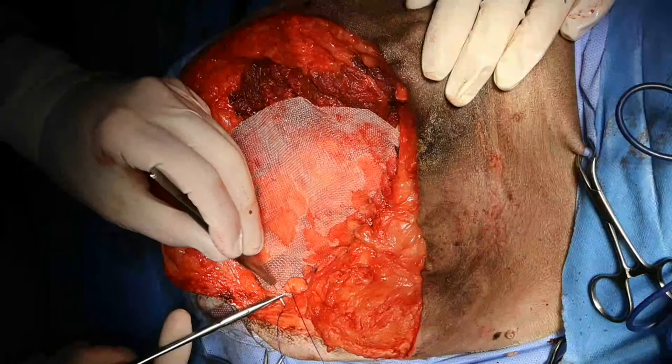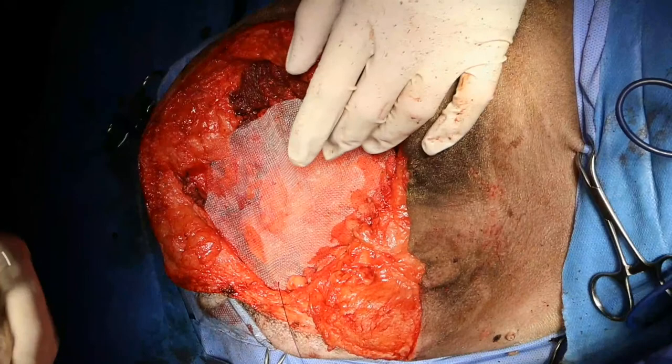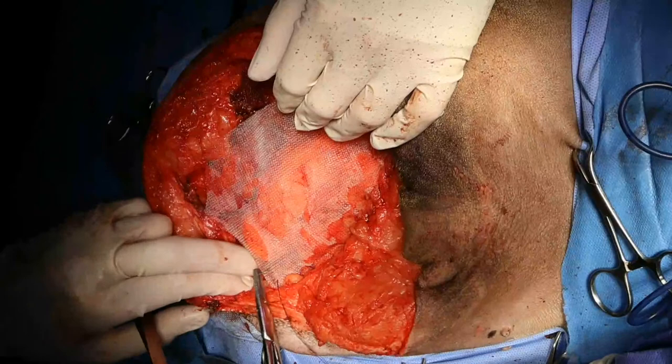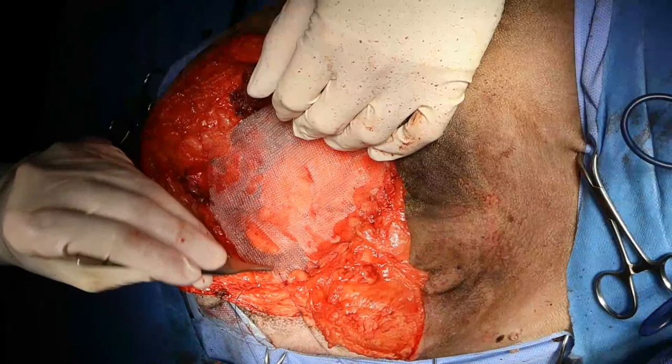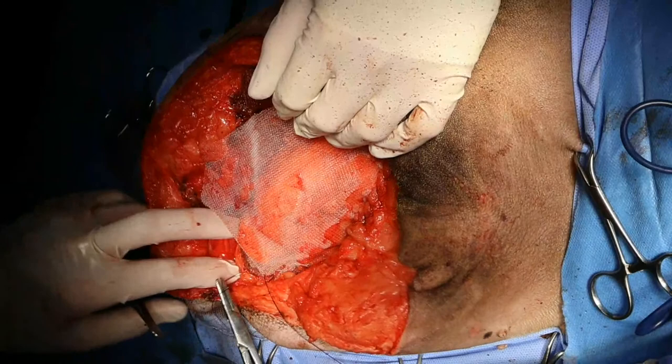Of the adductor now. Be careful not to suture into the urethra. That would be embarrassing, and rather uncomfortable, I would imagine. What do you do to avoid it? I just know where it is.